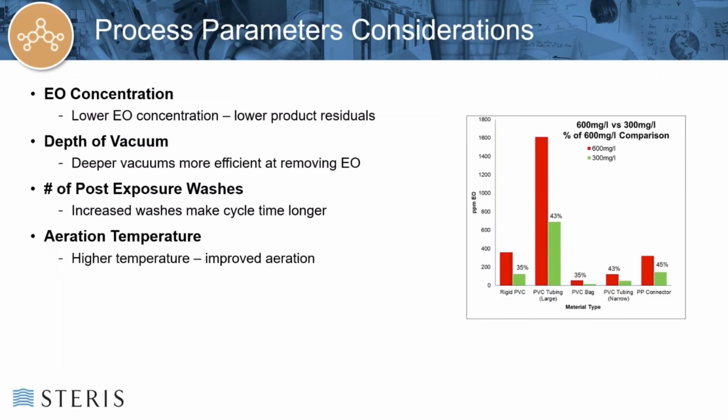How products are palletized can impact effectiveness of aeration. If boxes are densely packed and palletized, residues may be harder to remove. Pallet wrapping materials could also have an impact in effectiveness of aeration, such as netting versus plastic film. The design of packaging can aid or hinder the aeration of product. Layers of packaging and large instruction packets make it more difficult to remove EO residue during aeration.